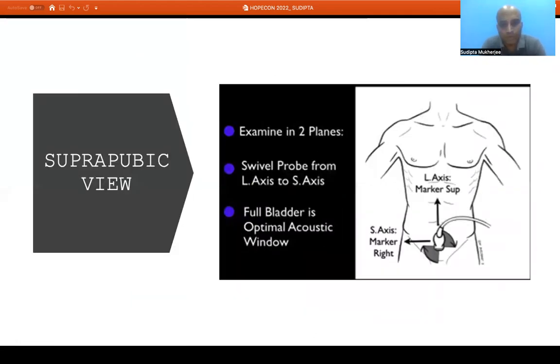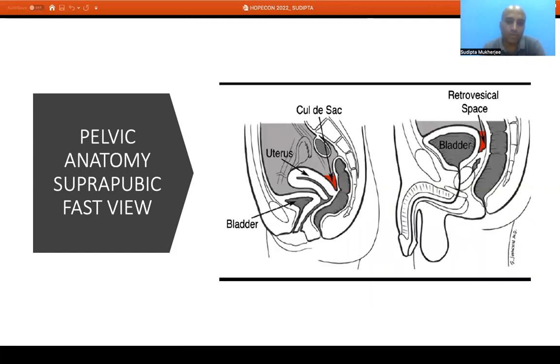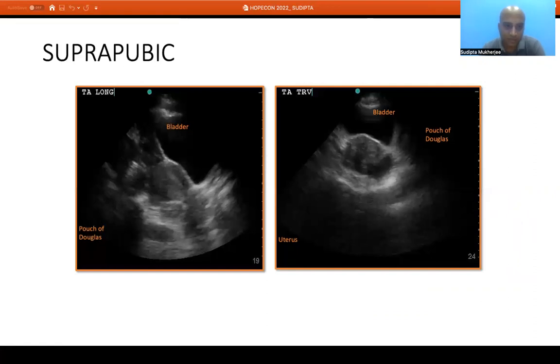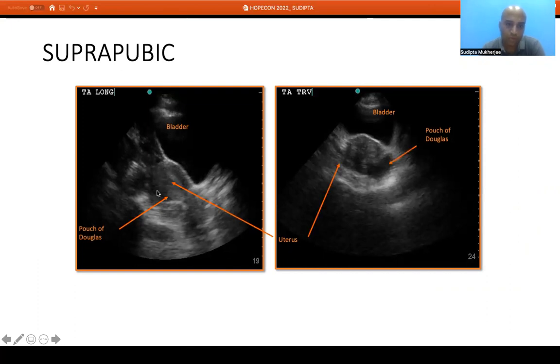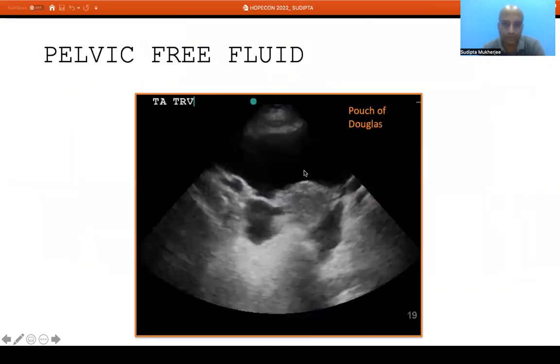The suprapubic view assesses the suprapubic area in both longitudinal and transverse axis. A full bladder is desirable as fluid provides an optimal acoustic window. In females the most dependent part is the rectouterine pouch — the pouch of Douglas — and in males it is the rectovesical space. In longitudinal axis we can see the bladder and the posterior dependent space; in transverse axis we can identify the pouch of Douglas and small amounts of fluid collection there.